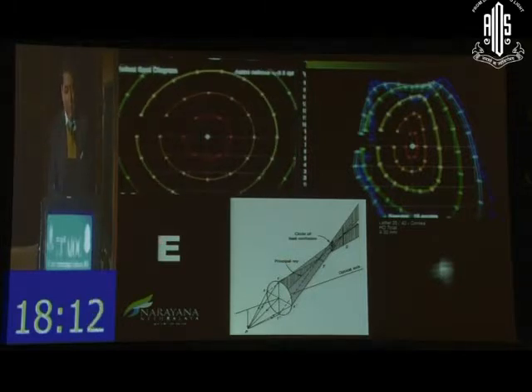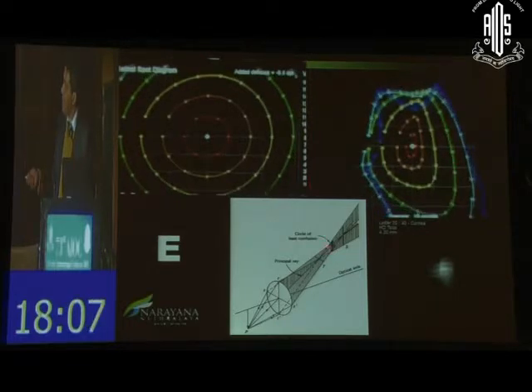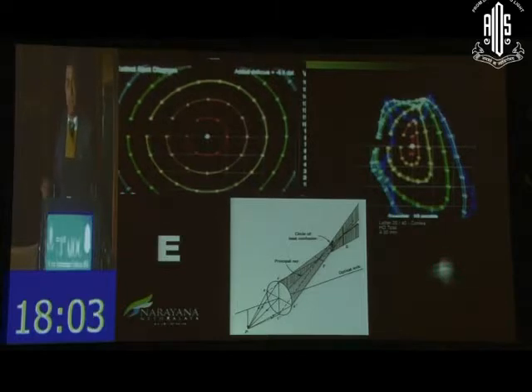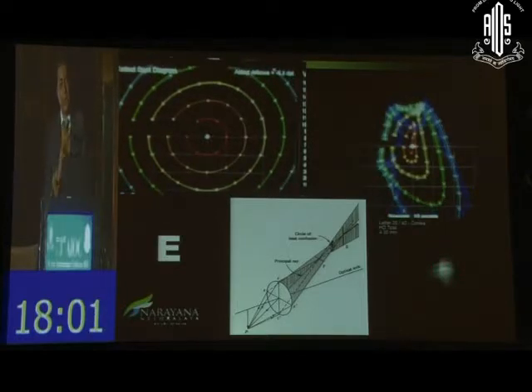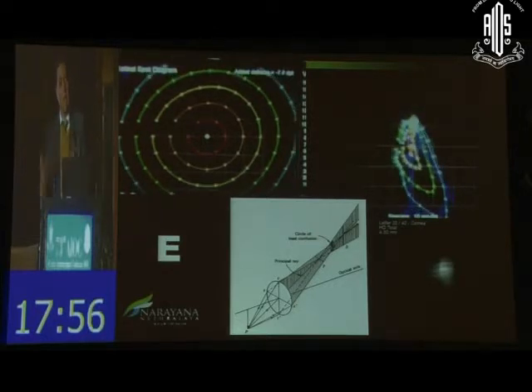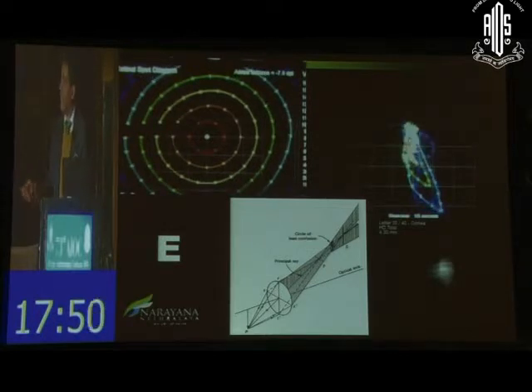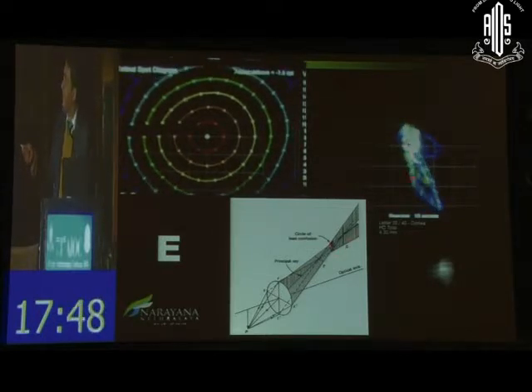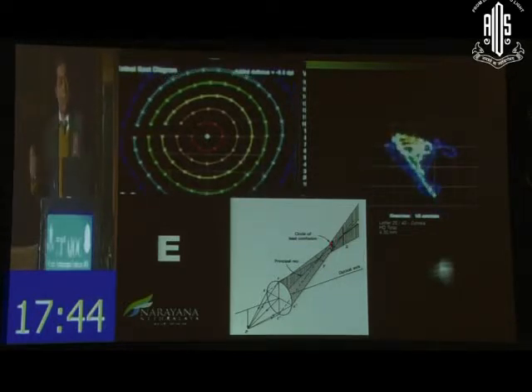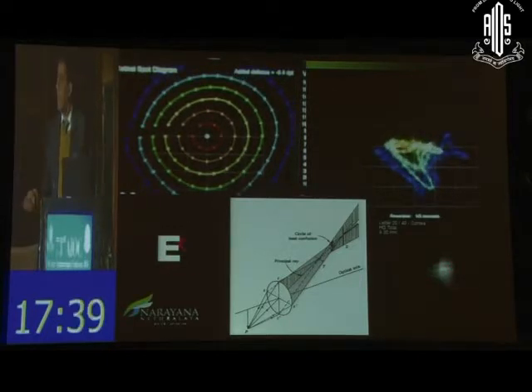For example, if you get this kind of an image where the lights don't form at one point, ultimately you have an image which is a scatter. So aberrometers today can help you decode and see what is actually happening in the patient from an optical point of view, from a geometrical point of view. For example, if this is not falling at this point, the circle of least confusion, that's why you have an image which is completely scattered out. And here you're falling at that dot point, and that's why you have a crisp image.